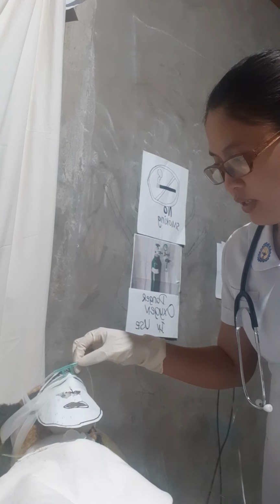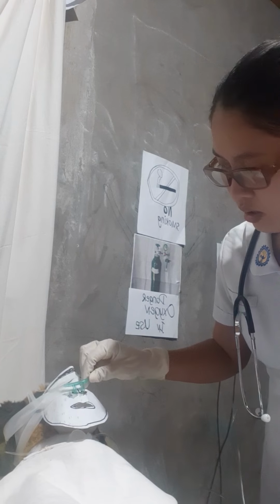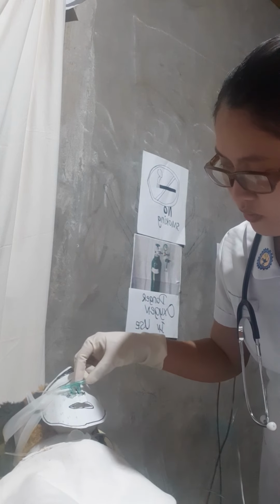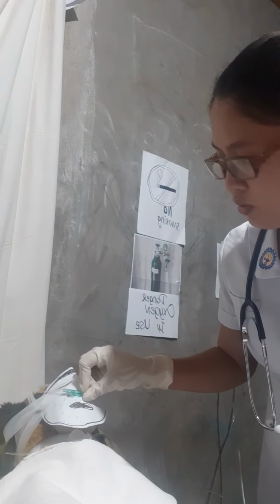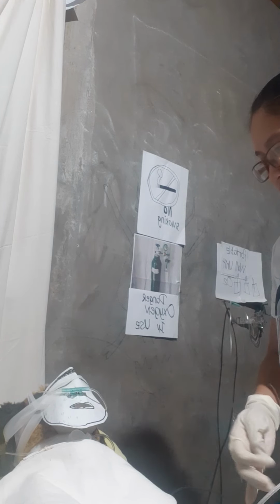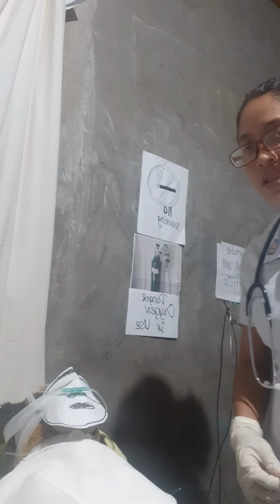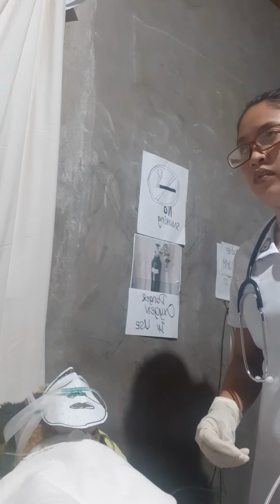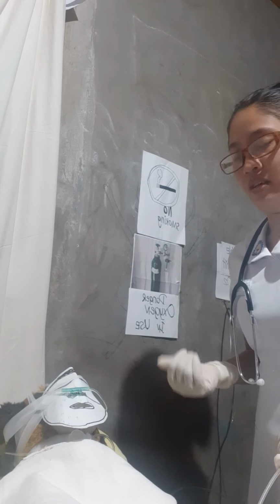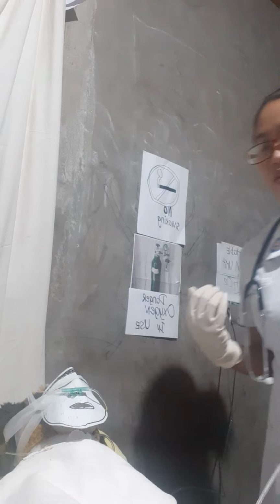afterwards, replace or put the oxygen device back to the nose of the patient. And advise the patient if necessary to take a deep breath if he or she feels better after the suction.